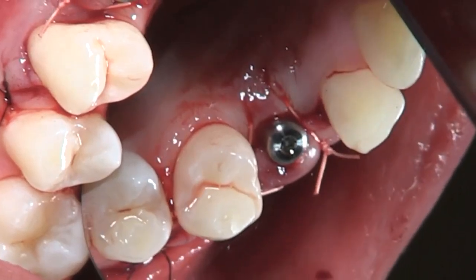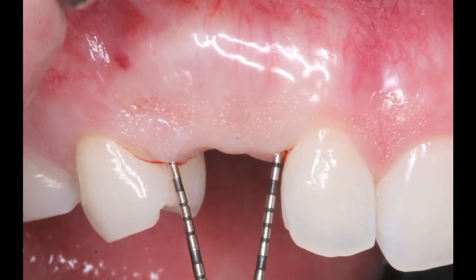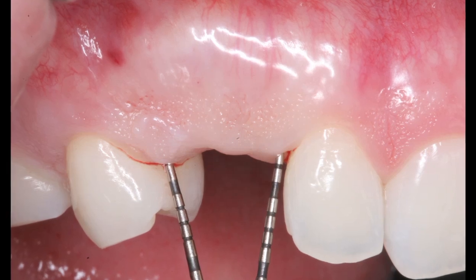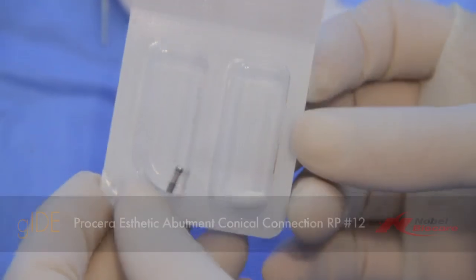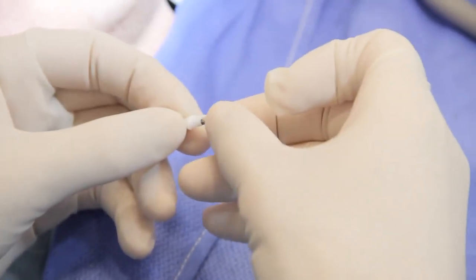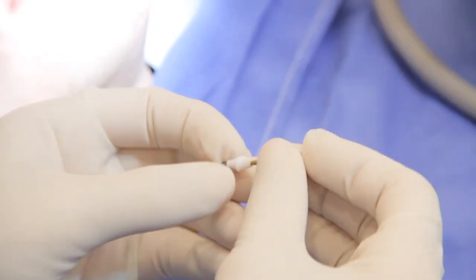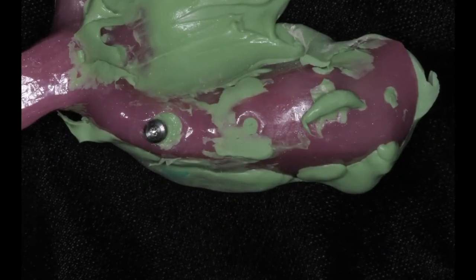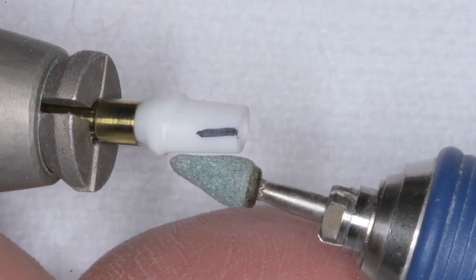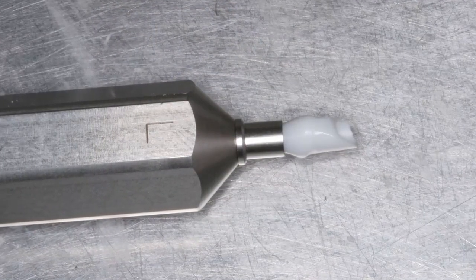Based on the gingival thickness and the measurements taken around the implant, a zirconia stock abutment is chosen with the appropriate height and dimension. In this case, the number 12 regular platform zirconia abutment. This stock abutment will be used in the laboratory phase to fabricate the temporary acrylic crown. It can either be done in office or out of office in a professional laboratory.